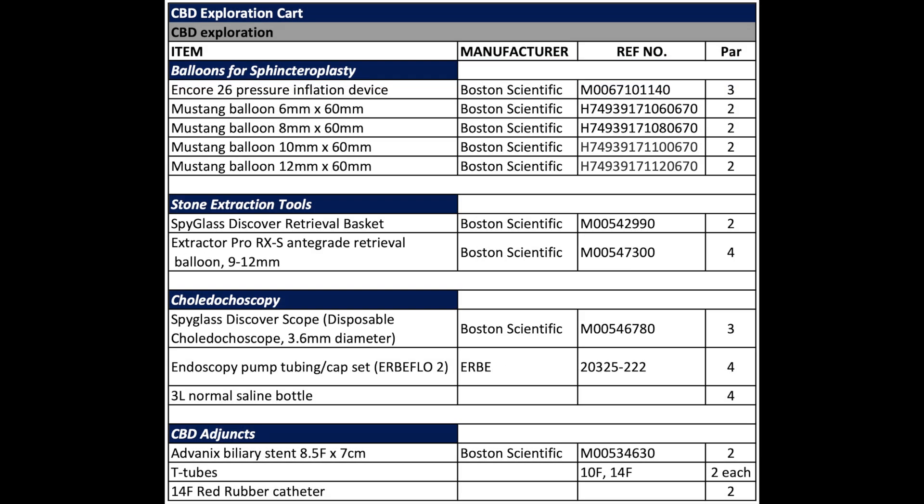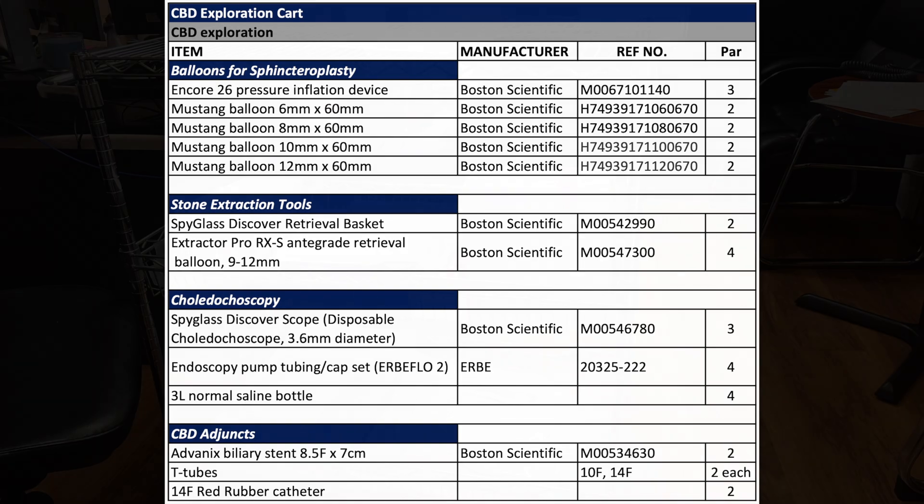This is our PAR sheet for the common bile duct exploration. If you are not able to obtain the spyglass choledocoscope, you can always use your hospital's ureteroscope. We recommend using a disposable scope if possible, as you will be manipulating it with the robotic arms, and it is also easier to get into a small cystic duct.